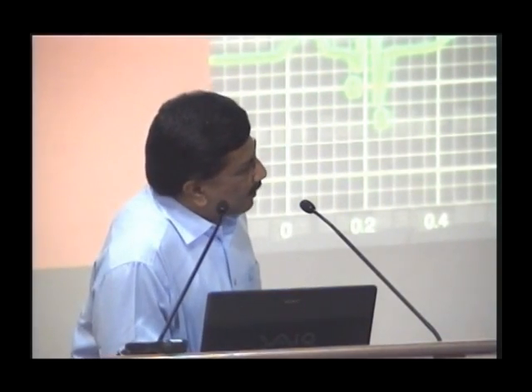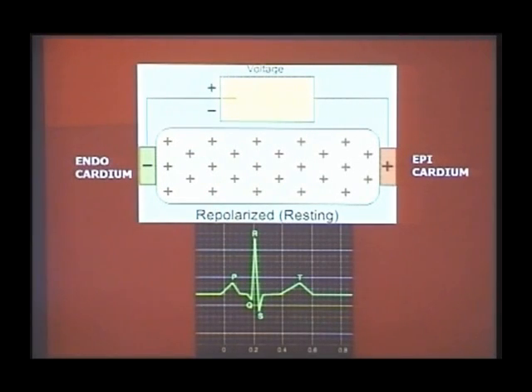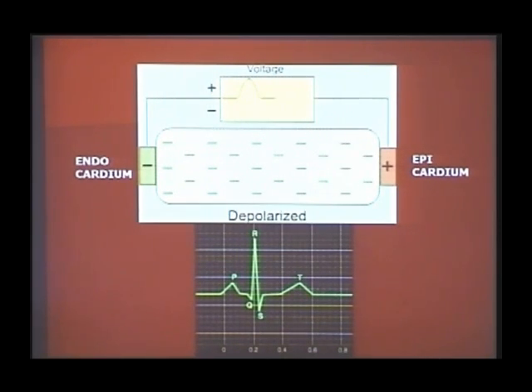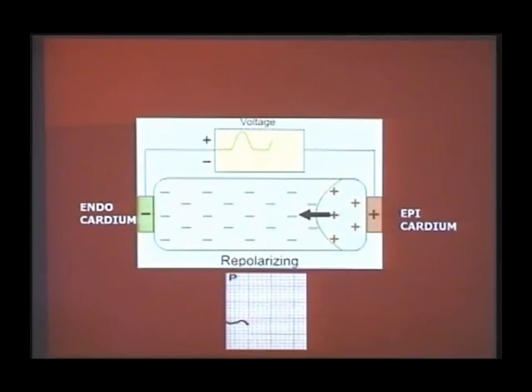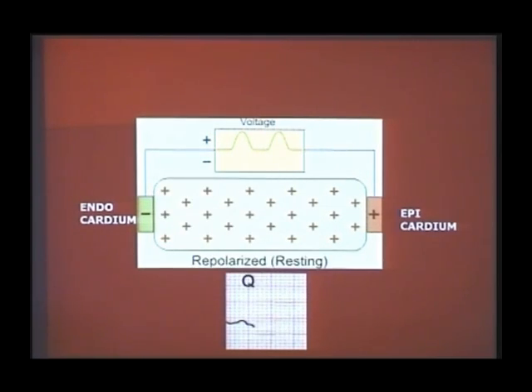Now, when you see the ECG, logically, when my QRS is upright, what should be my repolarization? The T wave should be negative, because when the depolarization is positive, we saw the repolarization has to be negative. So ventricular depolarization produces the QRS complex and the repolarization produces the T wave. Both are in the same direction because of opposite directions.